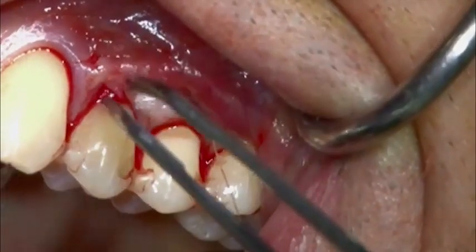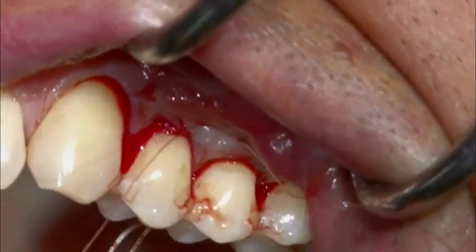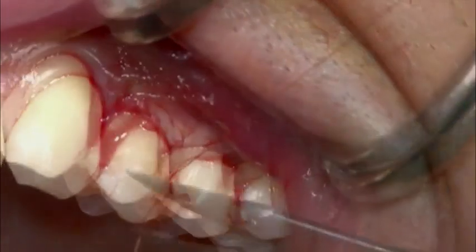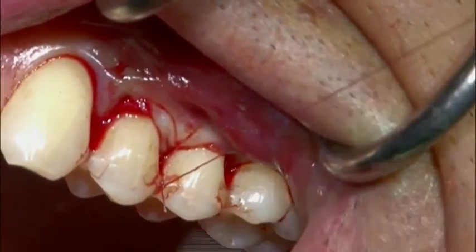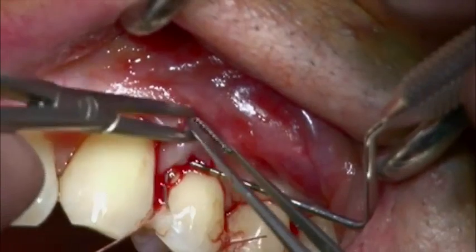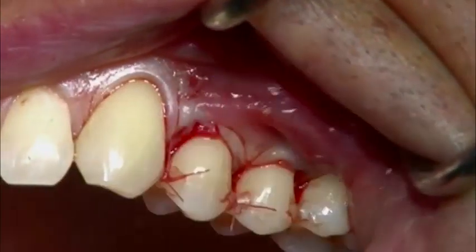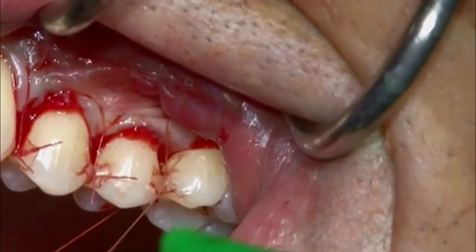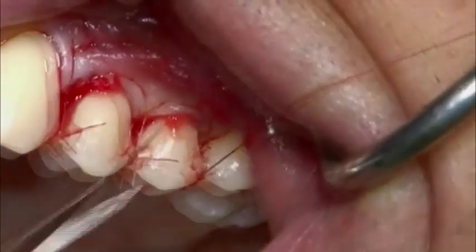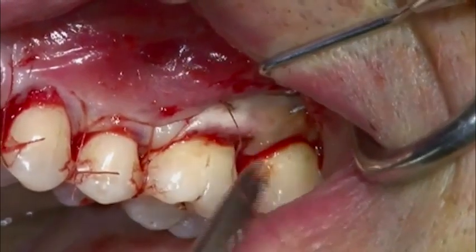A horizontal mattress suture is placed at the base of the papilla. The suture passes to the palatal aspect, back to the buccal aspect, around the splinted teeth, and is closed over the contact point. Each papilla is fixed with the same procedure. With this suturing technique, the elevated flap is advanced coronally and fixed one millimetre above the cemento-enamel junction. Care must be taken that the Geistlich Mucograft remains completely submerged under the tunnel, and that the flap, together with the matrix, are fully immobilised in a coronally advanced position. Finally, a sling suture is placed at tooth 2-4. For a successful outcome, it is critical that the flap and the matrix are fully immobilised in an adequate coronally advanced position.